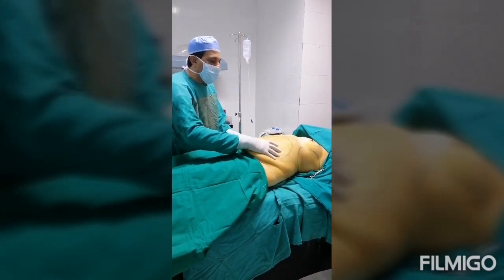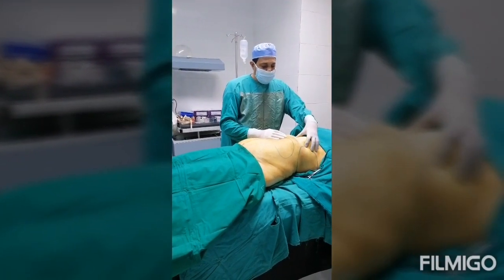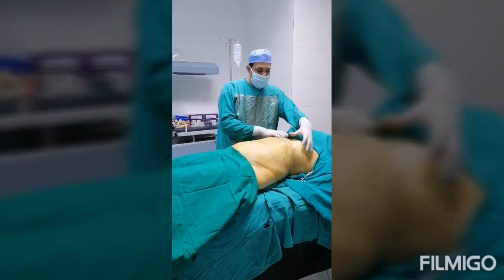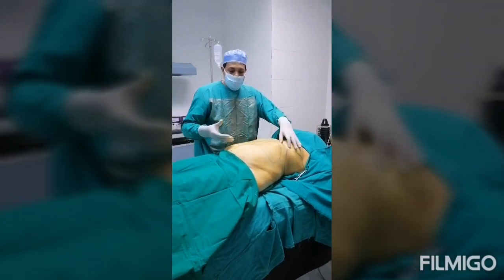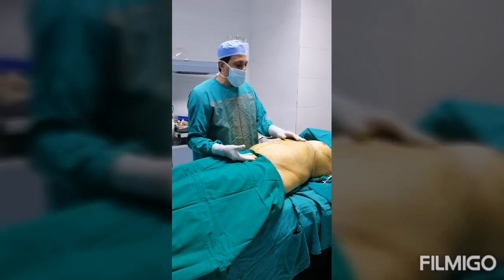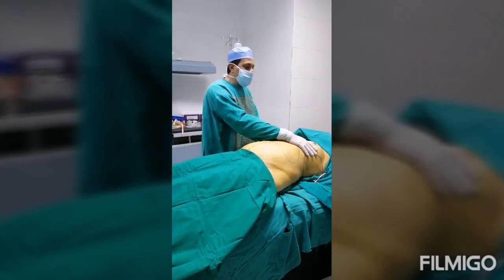At the same time, we'll also do a breast implant to shape her breasts. The breast implant will be inserted through the incision of the tummy tuck, which is down from the abdomen, so most scars will be in the lower area rather than visible on the breast.